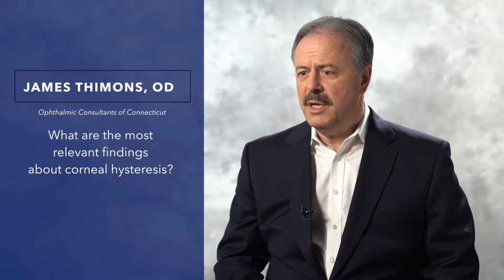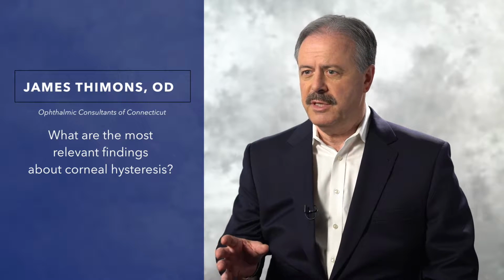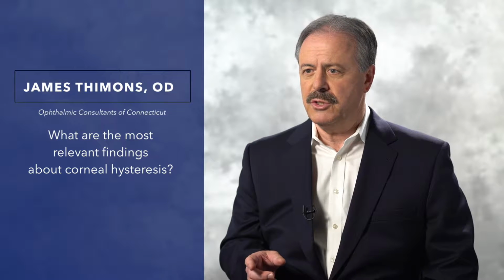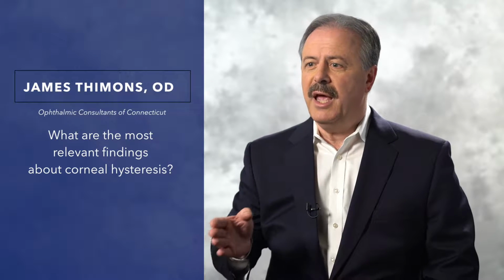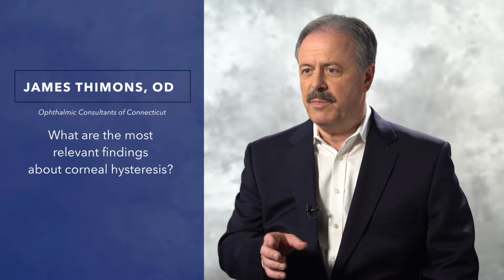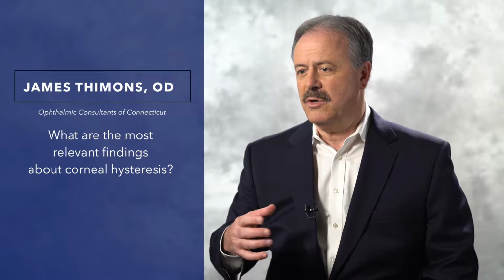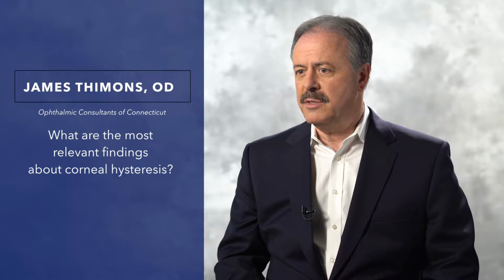In glaucoma suspects, that same information can be used to translate the decision-making on the part of the clinician as to who becomes the patient for treatment and initiating earlier treatment in individuals at risk based on that factor versus our traditional assessment of the other variables involved in glaucoma assessment.